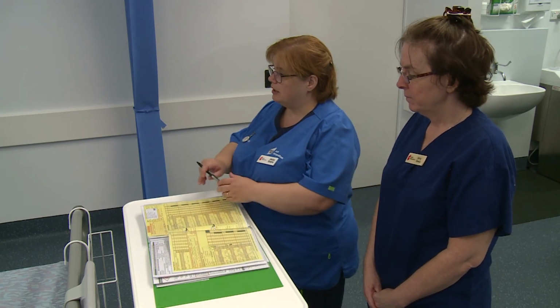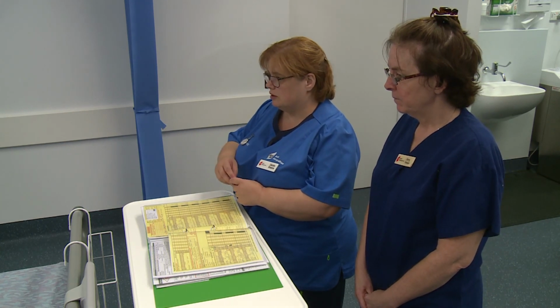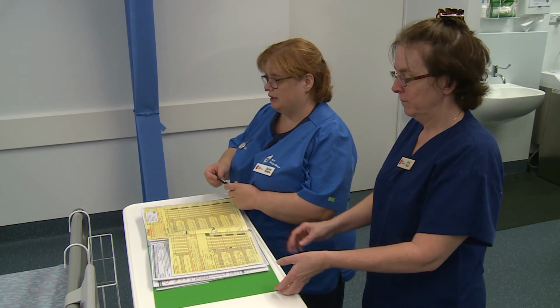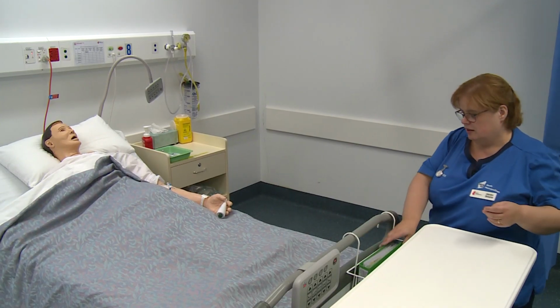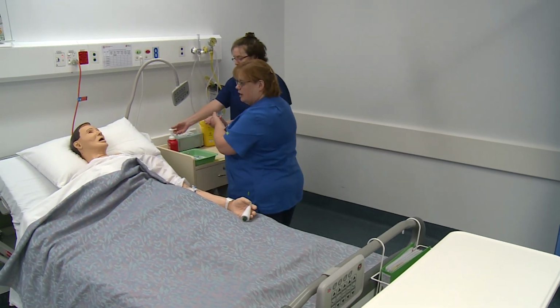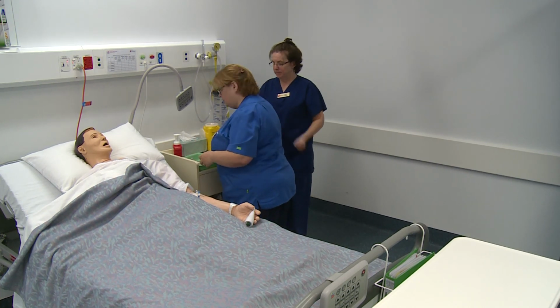Okay, so we'll be back in 15 minutes to check on you. In the meantime, you have your call bell, so give us a shout if you feel any different. Okay, see you in a bit. All right, pop that back. Hand hygiene. Pick up my tray, and we'll see you in 15. Okay.